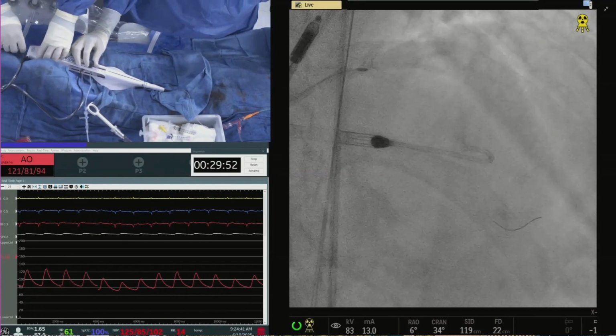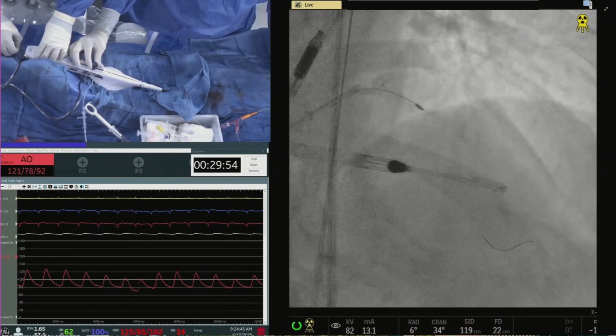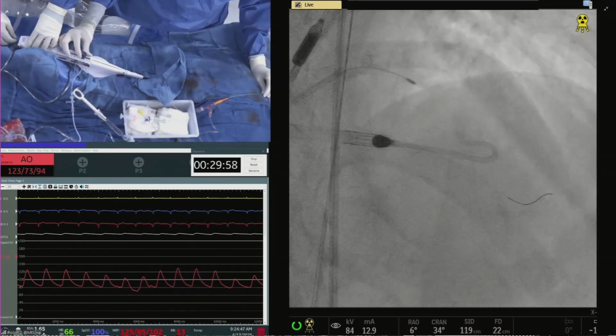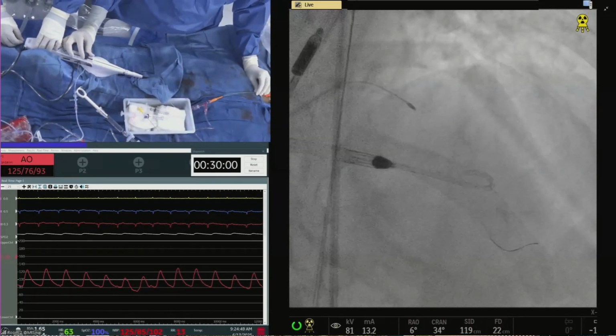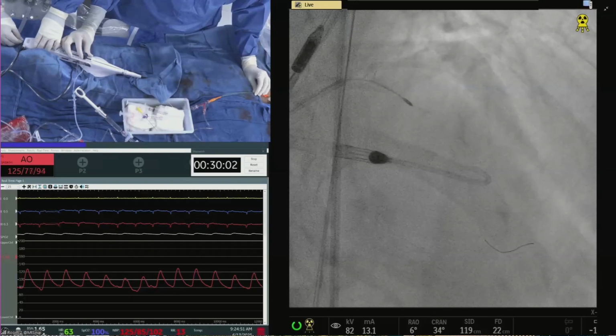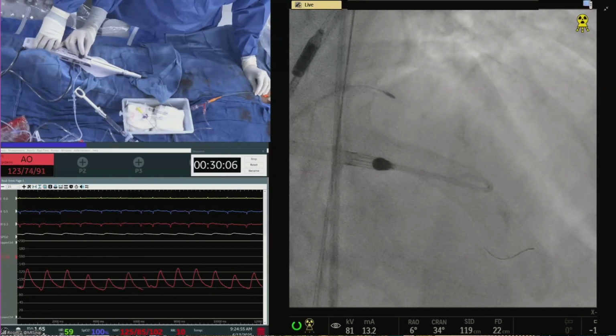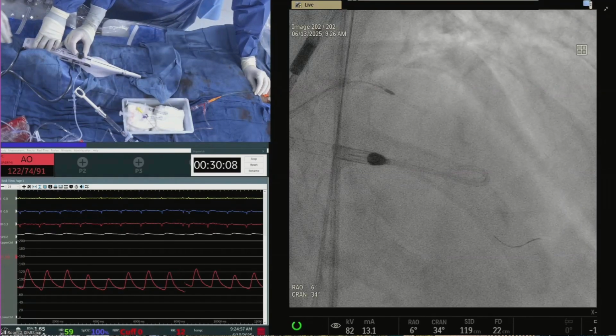I agree with the points discussed so far. I see how you're pecking very slowly. Slow pecking motion, yes. Dipti, any thoughts? You will hear that go a little bit higher speed. 150, yeah, a little bit higher, 155, yeah.